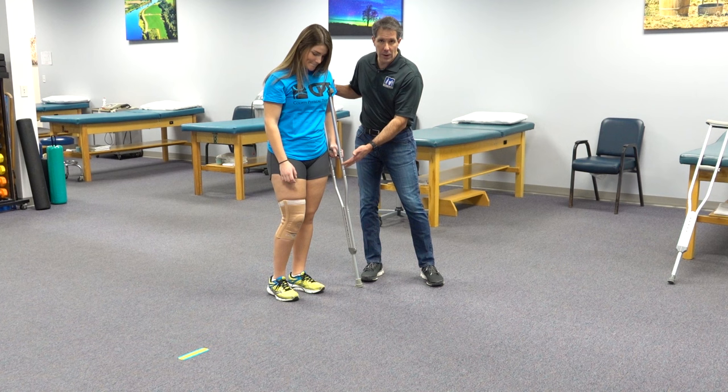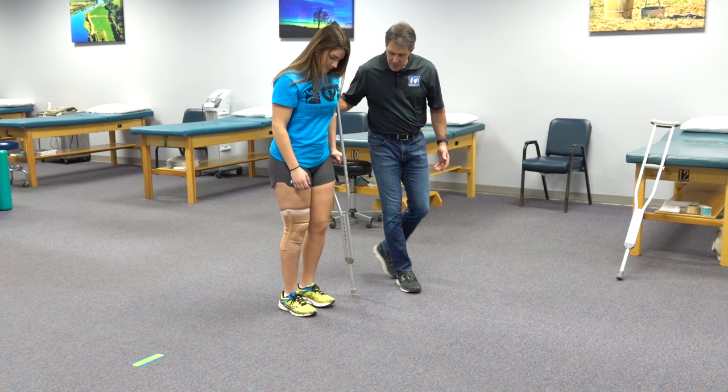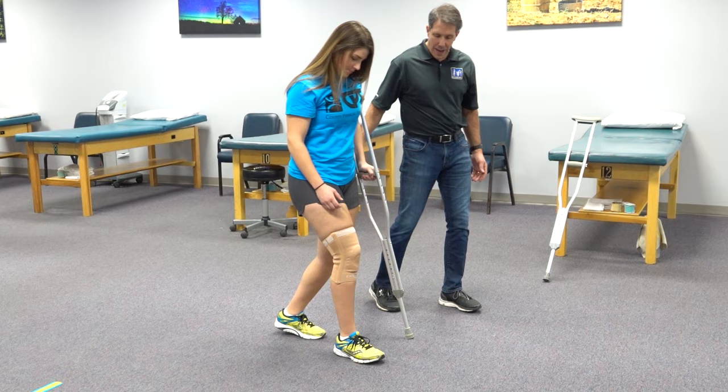So when you do this, the affected leg always follows the crutch. We're going to go ahead and take a step — bring the crutch ahead with the affected leg. There you go, this is step two.